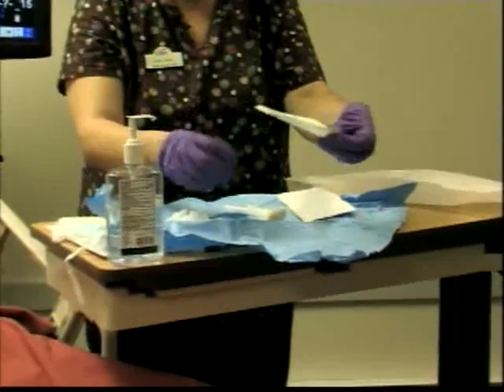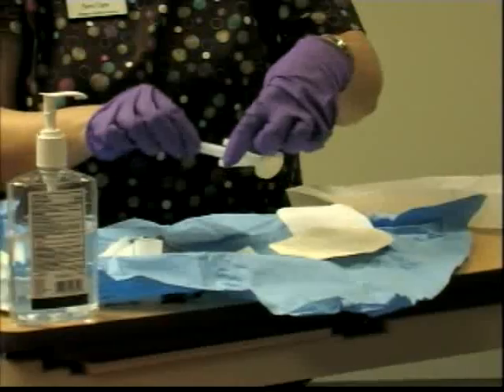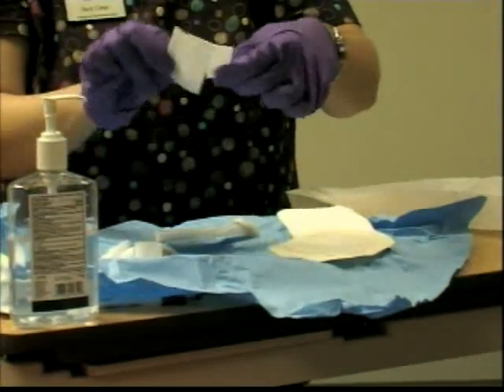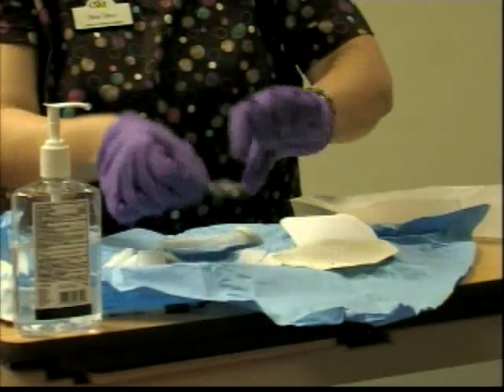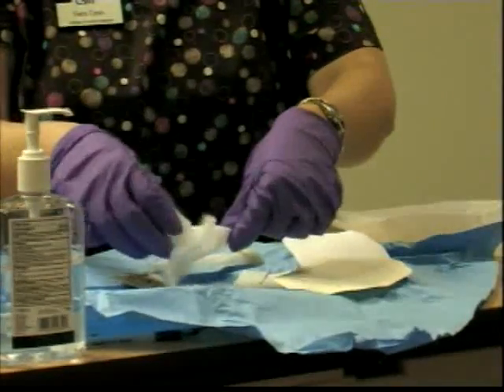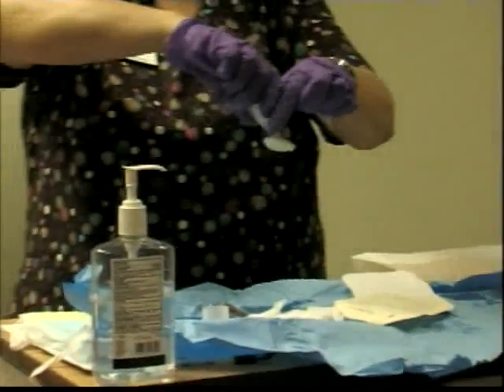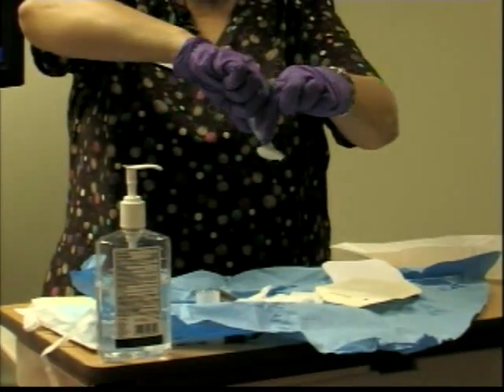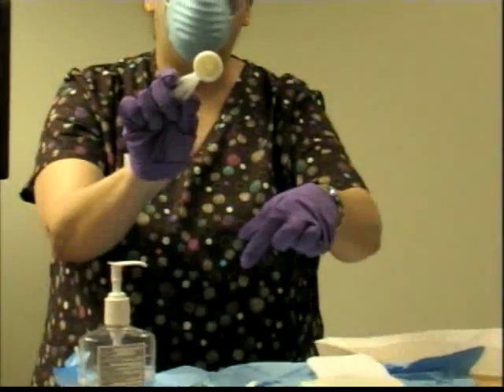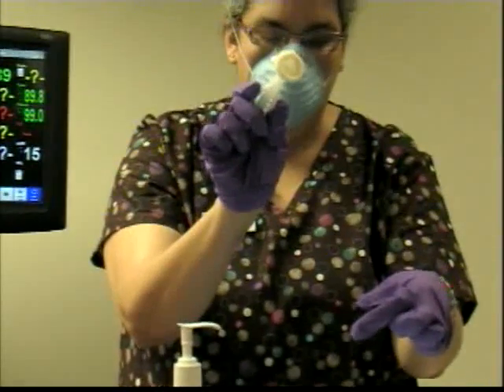You have the big Tegaderm that covers the whole area. You have one alcohol. We have one ChloraPrep. We have an extra gauze, a split gauze too, and your label. Okay? So the first thing that we're going to do then is to use the ChloraPrep. You're going to grab both ears and you're going to break it. I'm going to shake it, and it actually covers the whole pad. Now you notice that you only have one pad, okay?